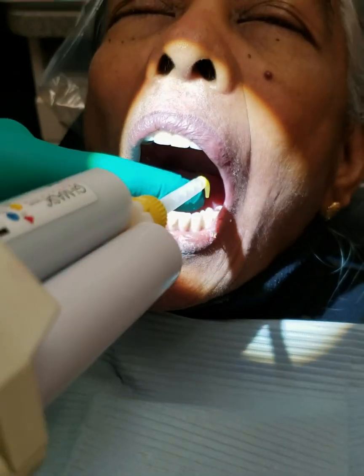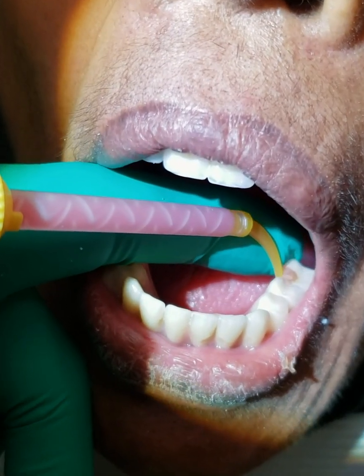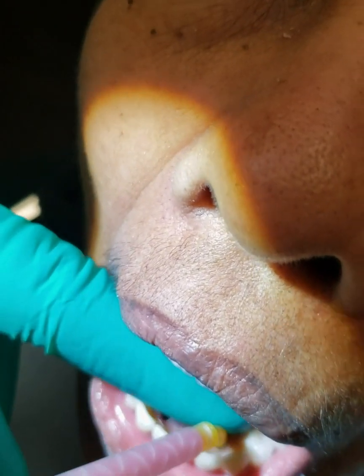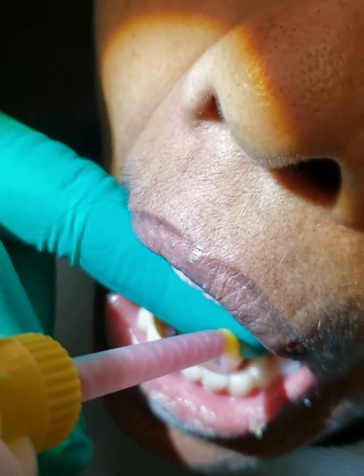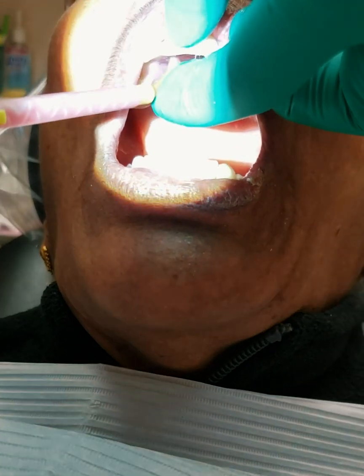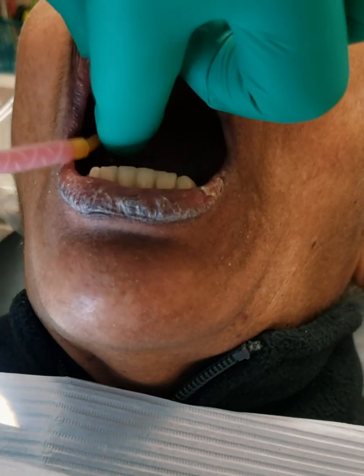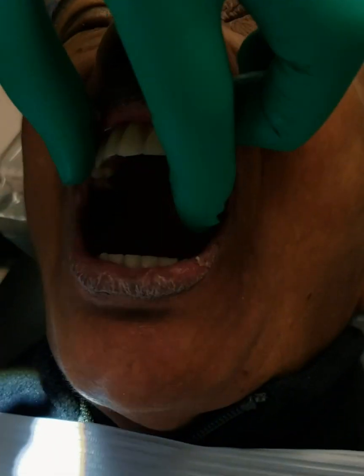The last step is you go through and put back in the GI mask to cover the holes up once the prosthesis has been put back in. Now the GI mask is put back in.